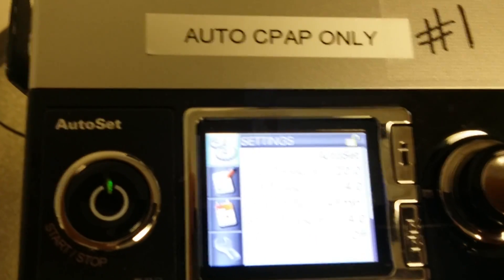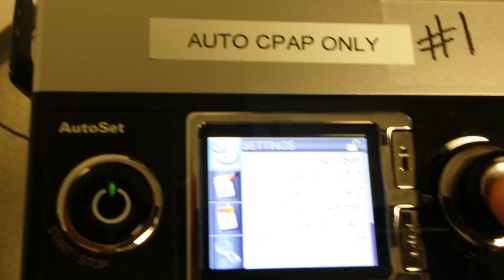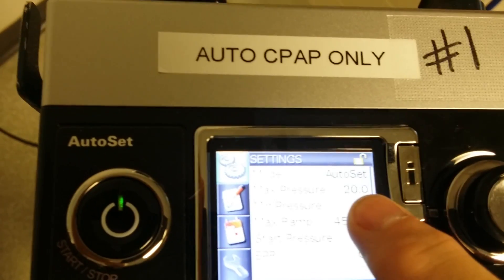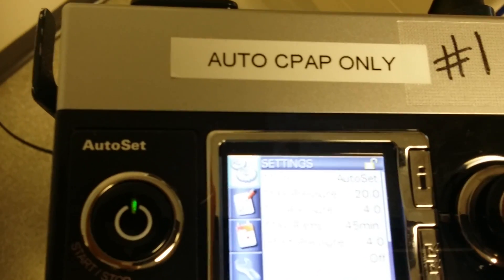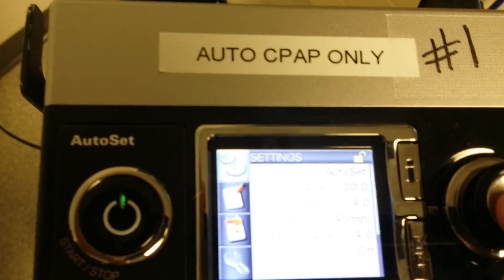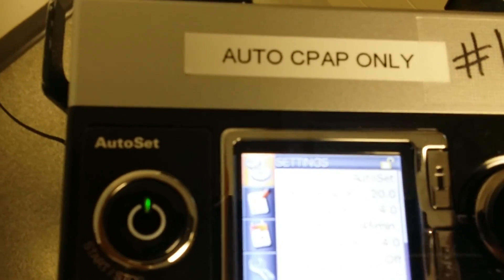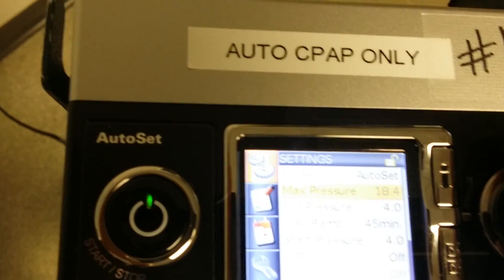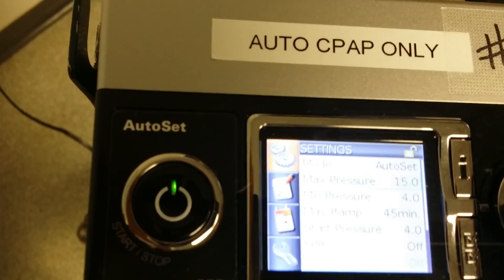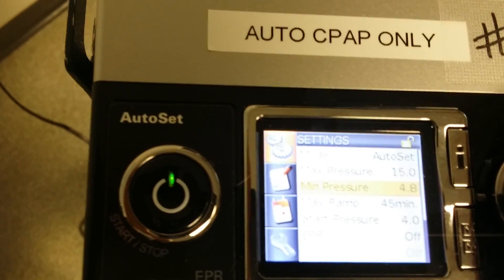What you want to do here is set the low and high pressures in the brackets — that's all you need from the physician's order. This machine defaults to a minimum pressure of 4 and a high pressure of 20. If you have a specific order, for example 15 over 5, click settings to go into that, scroll down to the high pressure and change it to 15, click to accept, then scroll down to the low pressure and change that to 5.